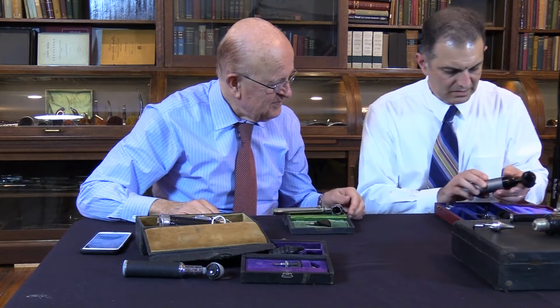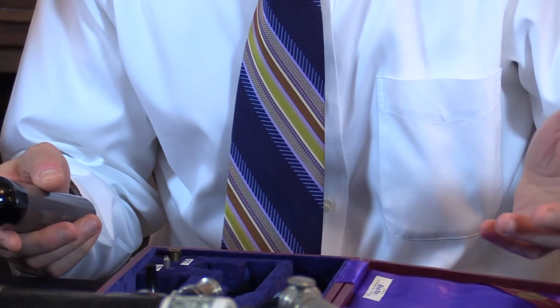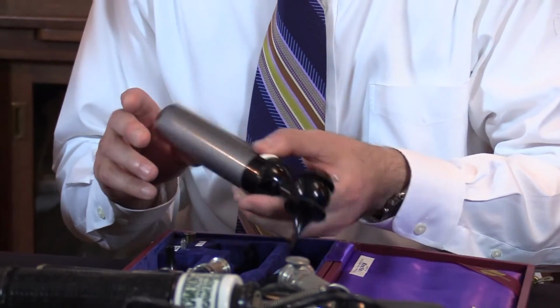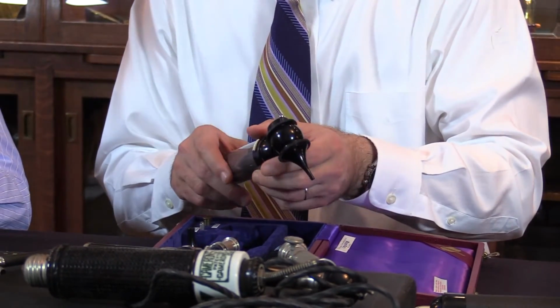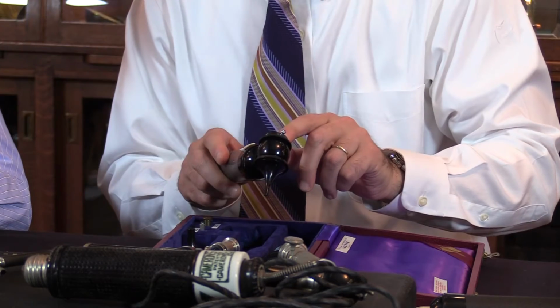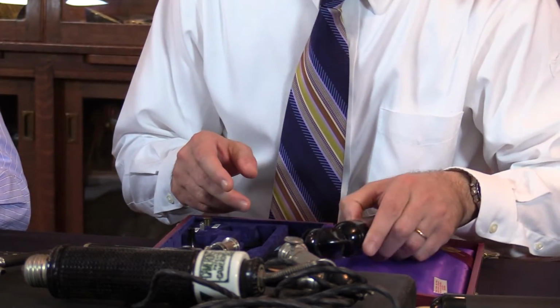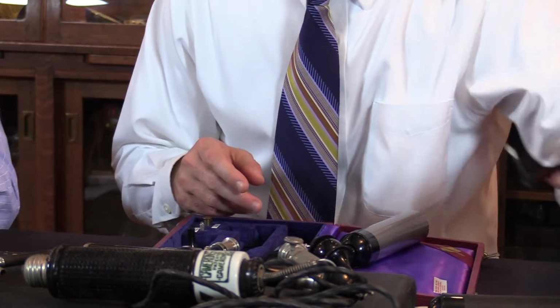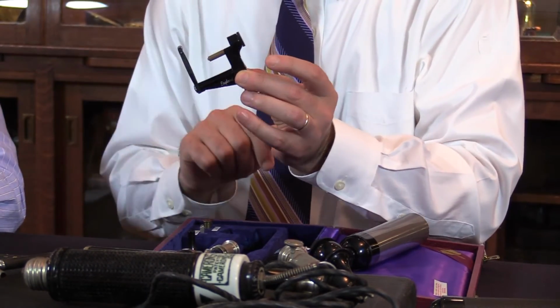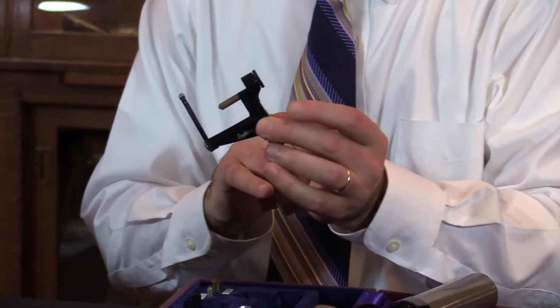So these scopes, similarly, this is an otoscope-ophthalmoscope combination, battery operated, with the complex lens here and a magnifying lens in here. I think you can see it better here. It's more open, where the speculum is tightened into this area, and you've got the lens here for magnification.